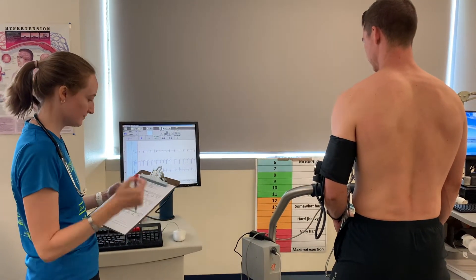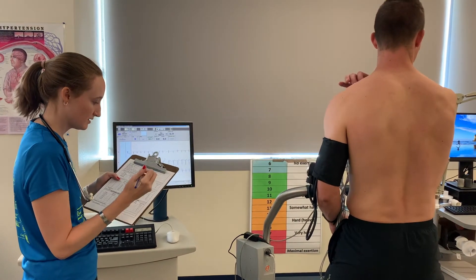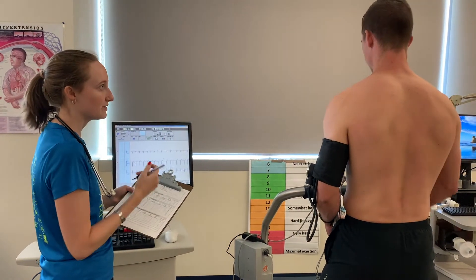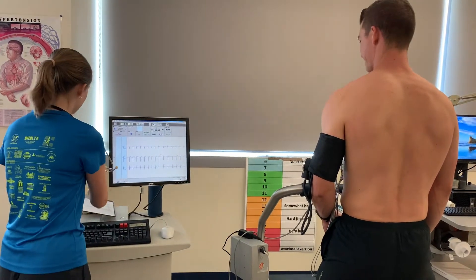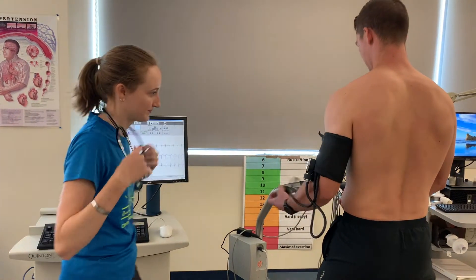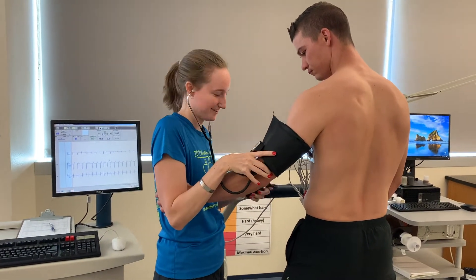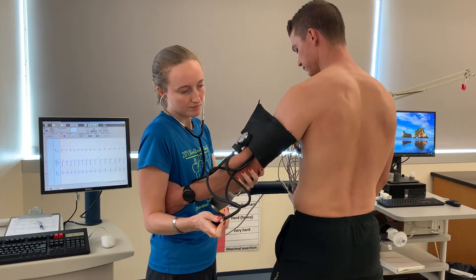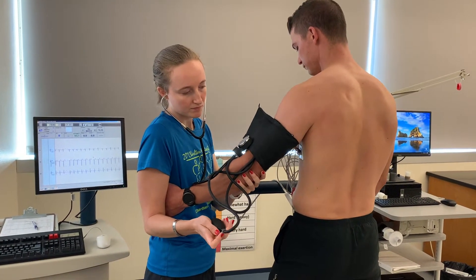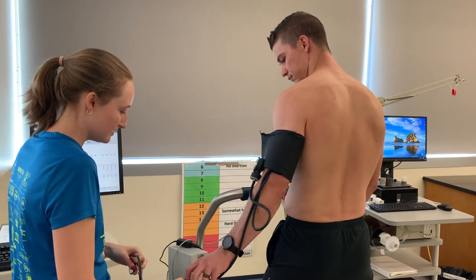We have his heart rate right here — I'll go ahead and write that down. It is 68. And what is your RPE at the moment? Six. Perfect. Let's go ahead and write down that blood pressure. Got 138 over 82.